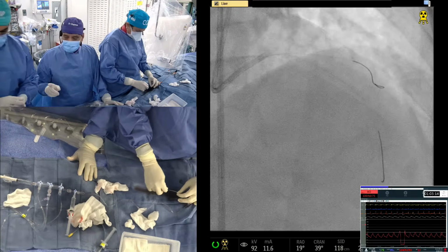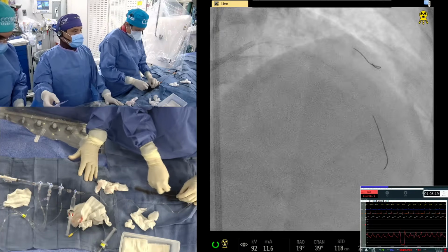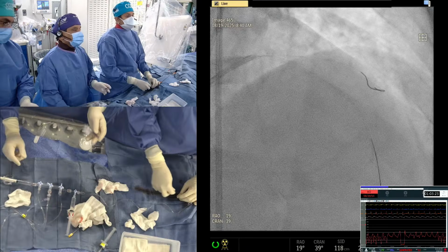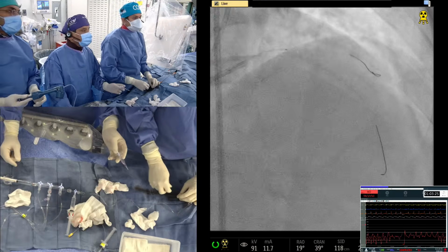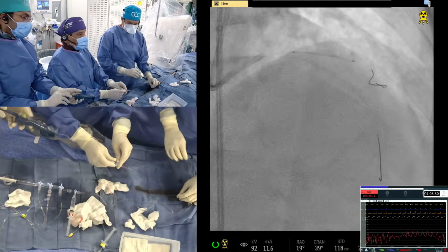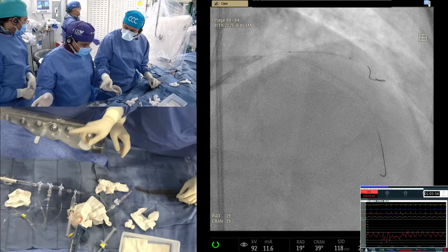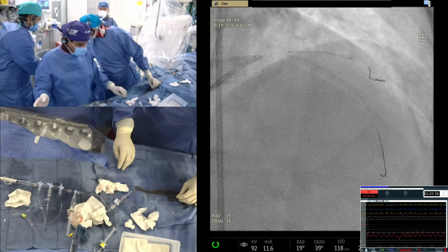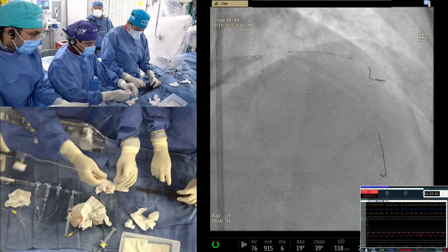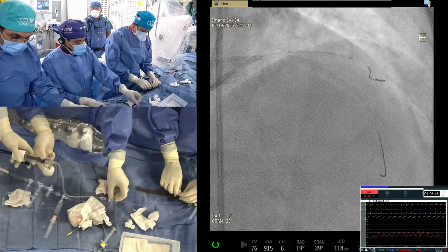Okay, we are going back again. This is the 2.25, 26 millimeter stent for the side branch. We have the 3 already. Good. So that ostium needed a little bit of cut. So we okay, leave it there. Good. Let's get it now. You don't have the white? Always, this is for the side branch. Okay. 3020. Sorry, that 18. Long? No. 18. 3018. Yeah.